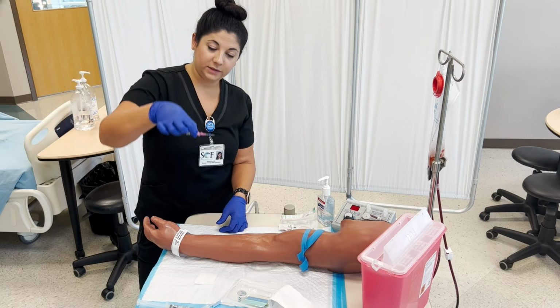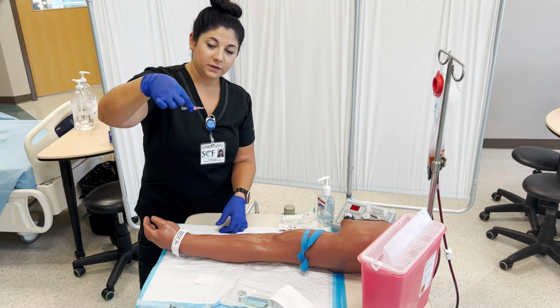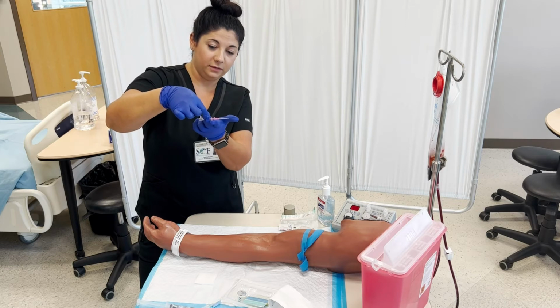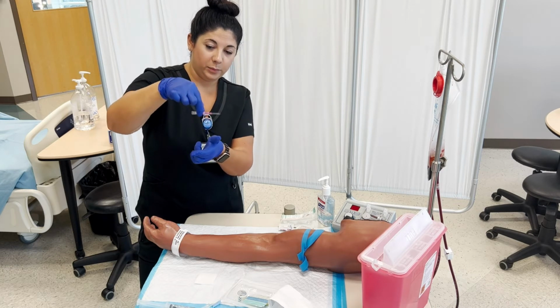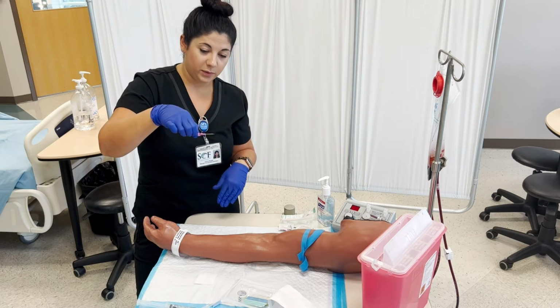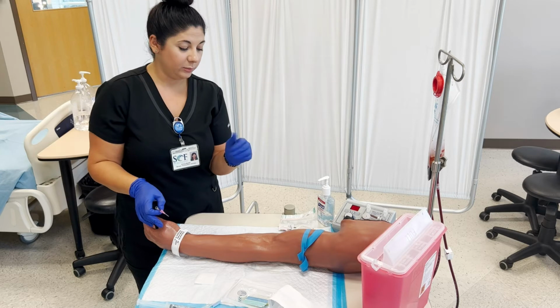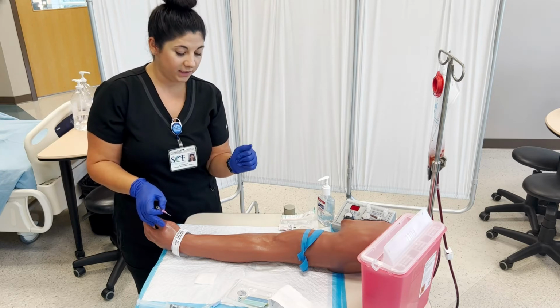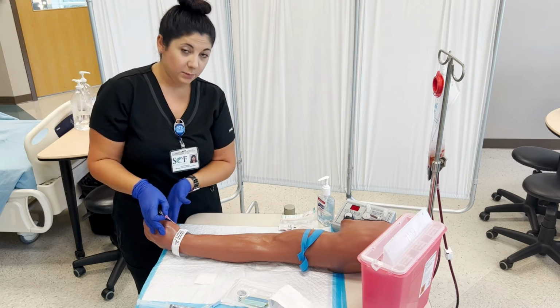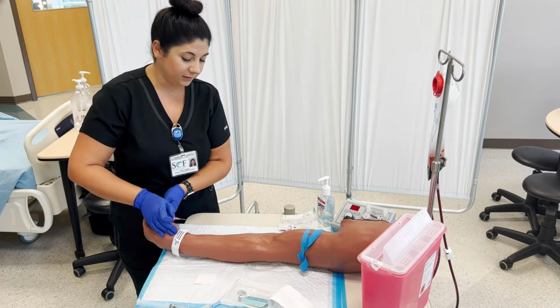And then you want to hold your needle with your 2 fingers, your thumb and your forefinger, so that nothing is underneath the needle. You're holding it up like this, pinching that. You want to make sure that the bevel is up. And then you can have your patient clamp and release their hand a few times to really pump up those veins, but make sure that their hand is loose before you put the needle in.